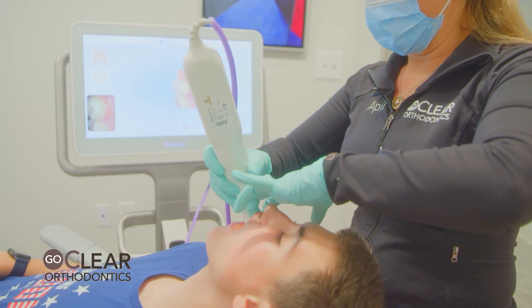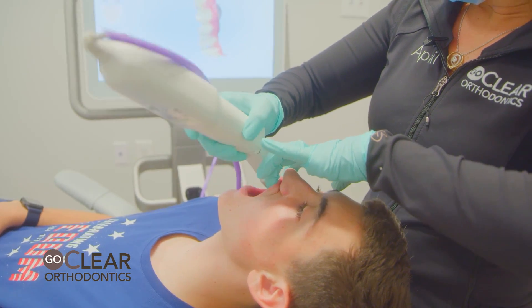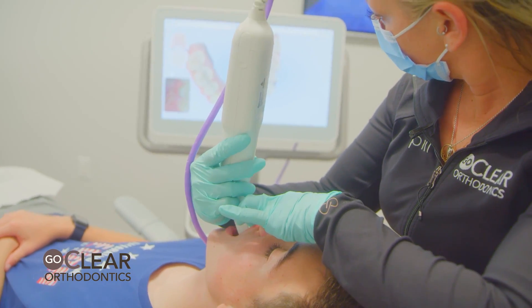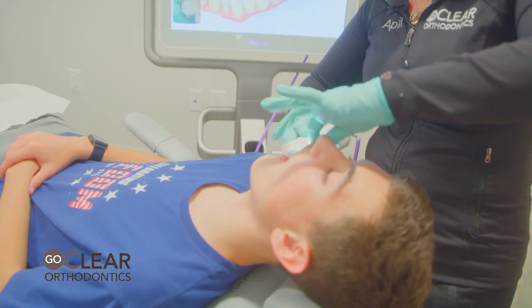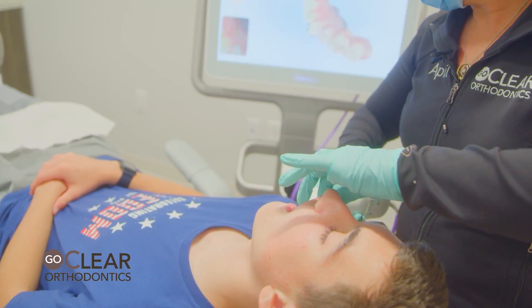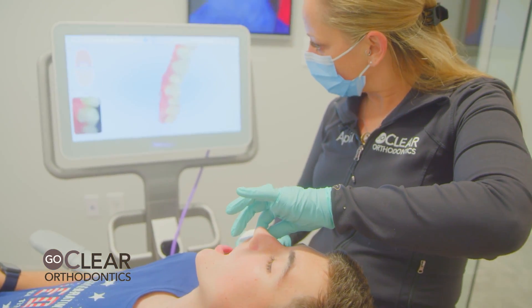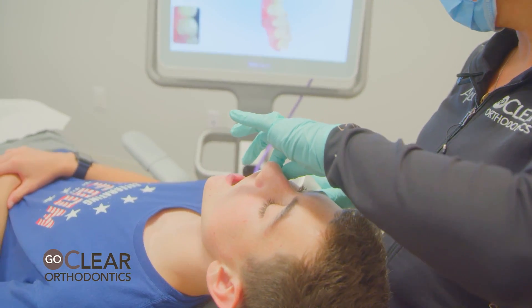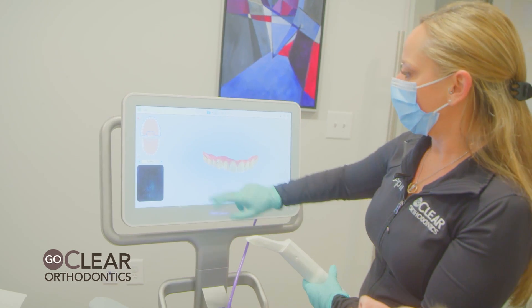Now we're going to the upper right — roll to the buccal. See how I'm using both fingers to hold his lip up. Scan to the midline, making sure to always get at least two millimeters of gum. There are a couple little blue spots here. Easiest way to get it: hold that lip out of the way, start on the lingual and roll to the facial. Sometimes these clear buttons can be difficult to fill in. Invisalign software will know that that's a clear button, but try to fill it in the best you can.